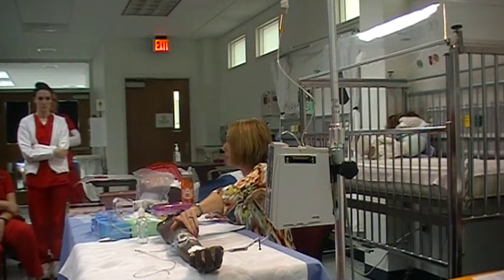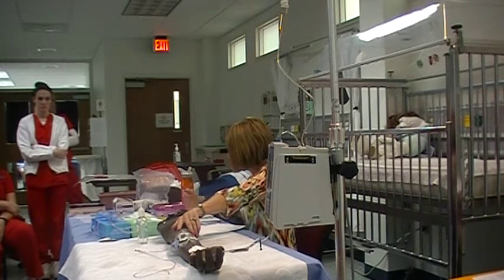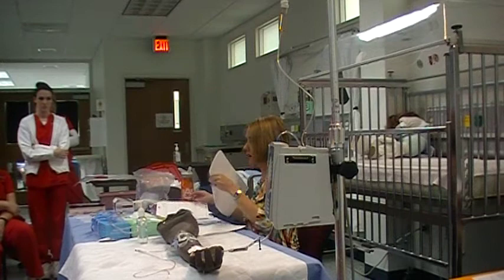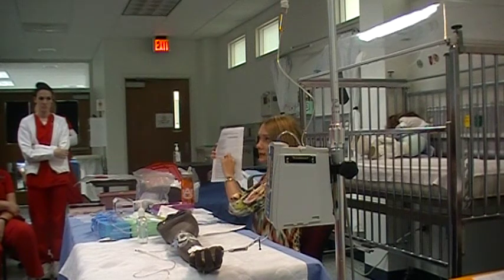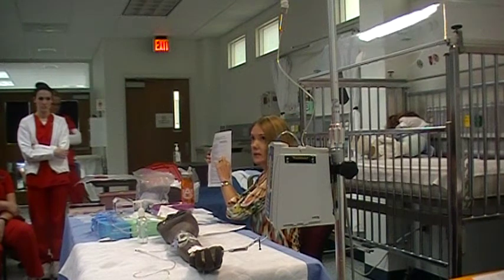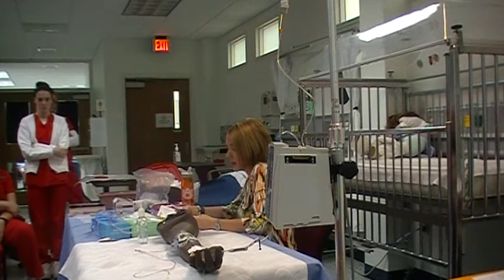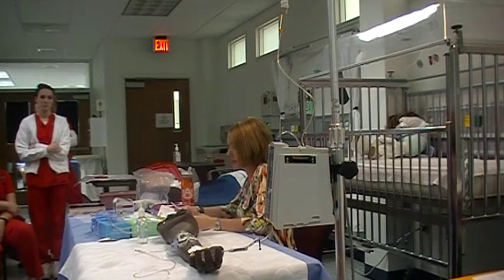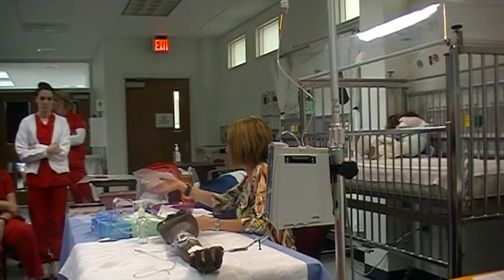If it is not compatible, you will say, this is not compatible with this medication. And then at that point, we know we're going to come down on our form. We're going to finish this, and then you're going to come back to the incompatibility section. Is that clear? So let's say this one is compatible. You're going to prepare your medication, so you'll be drawing up.